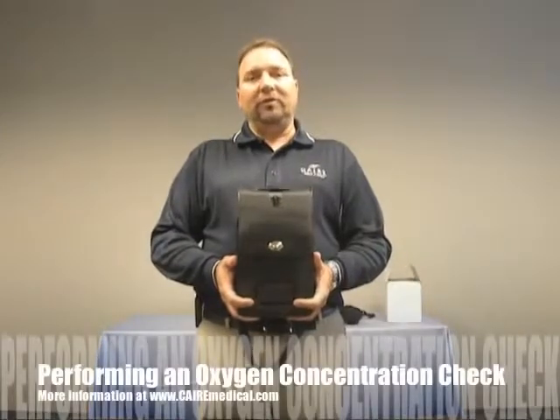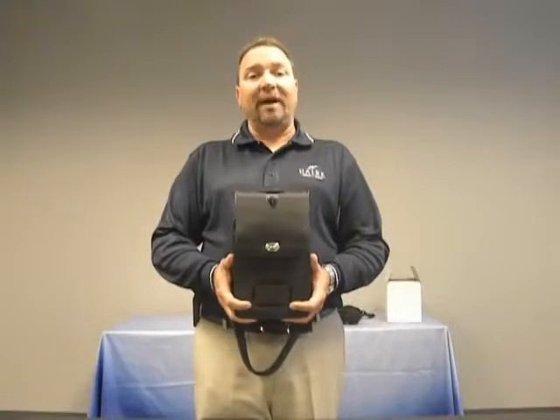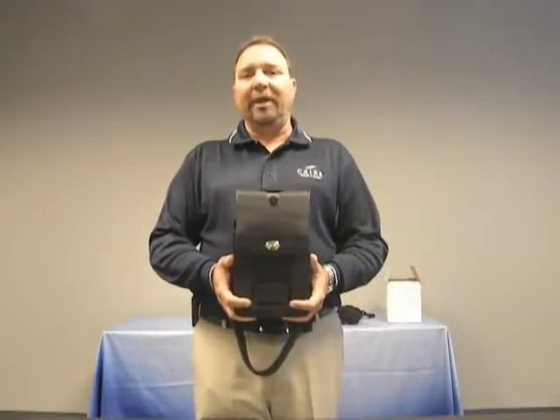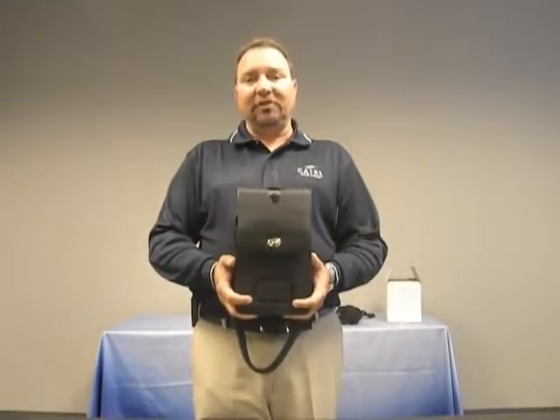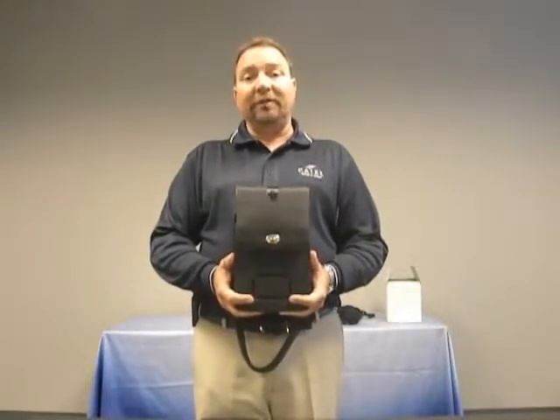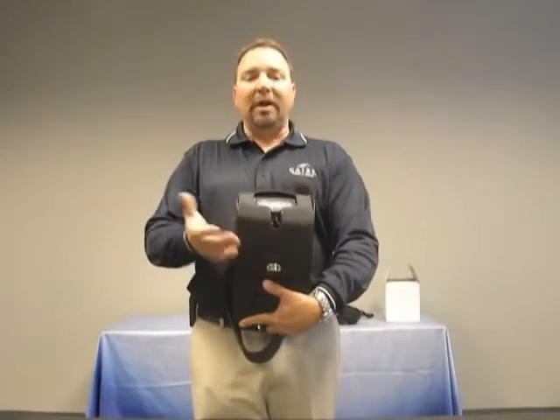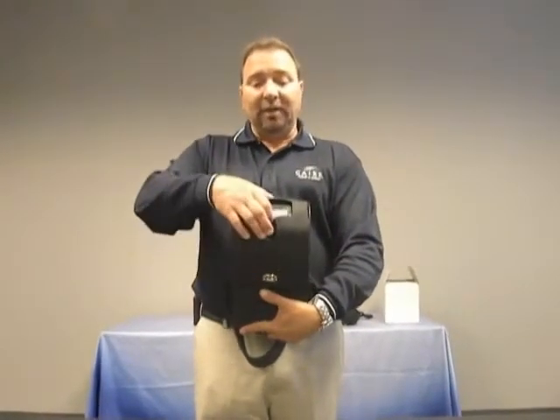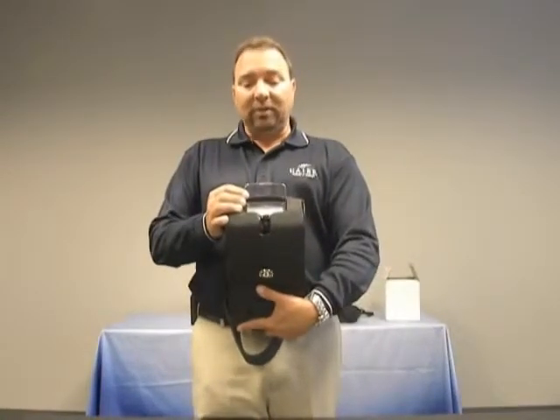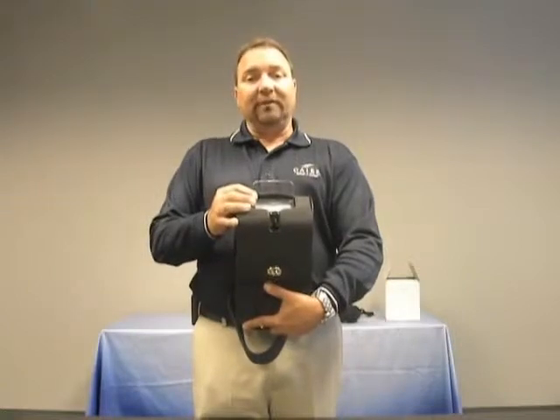Today I want to show you how to do a performance and oxygen concentration check on the FreeStyle 5 portable oxygen concentrator. As you know, periodic oxygen concentrator tests are required, and this applies to both portable oxygen concentrators as well as stationary concentrators. To perform an oxygen test with the FreeStyle 5, you would simply lift up the control panel cover and press button number 3 to start the device.